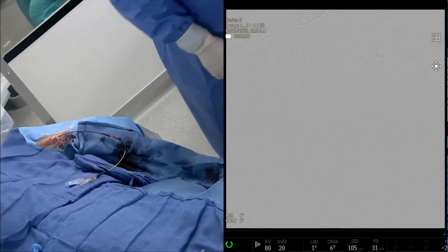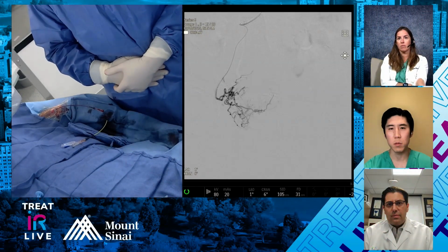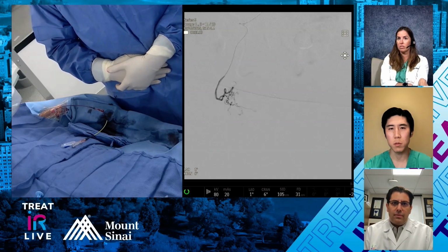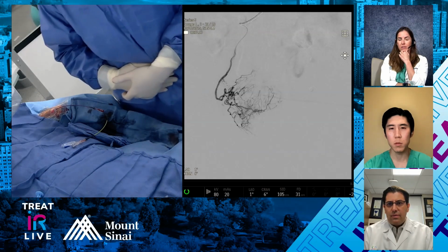Jeremy, it seems like a lot of the success when you're starting off with prostate artery embolization is going to be your setup, right? What catheter are you picking? Aaron is talking about using a balloon microcatheter. Are you routinely using that as well, or what other microcatheters are you using in your practice?